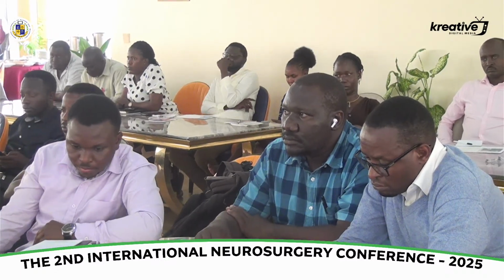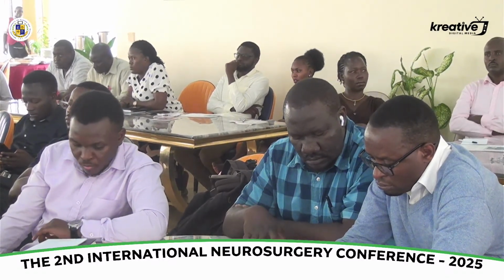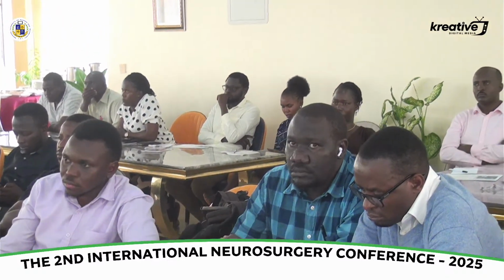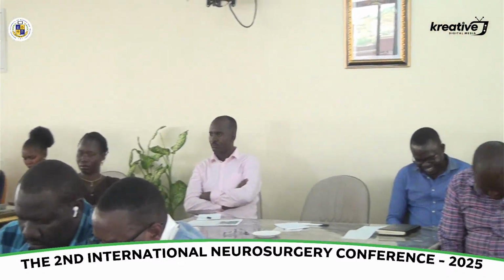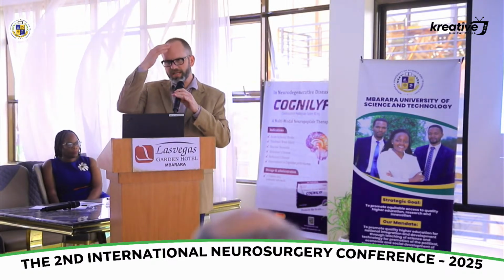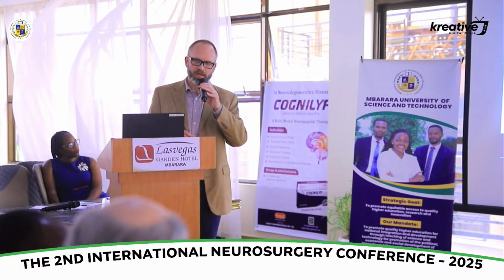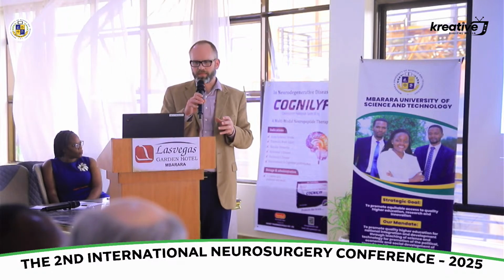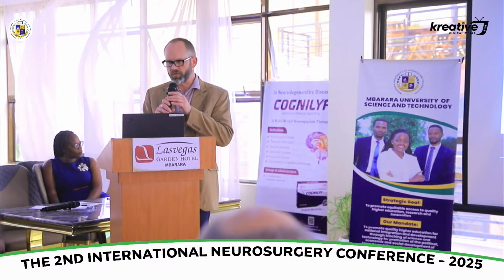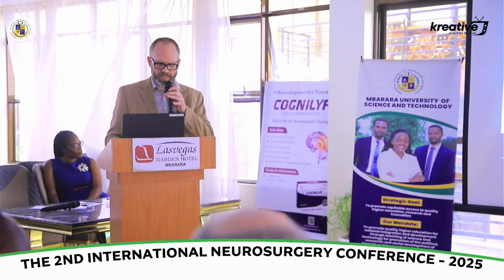So this will be a quick presentation. We'll spend more time on adult ultrasound, but it can be useful to get online images or a textbook of pediatric or neonatal ultrasound of the head, just because radiologists have been doing this longer, because of the fontanelles being open, to get good ultrasound images of the brain for a very long period of time, for decades. So while it's not exactly the same as an adult patient at surgery with pathology, it can be useful to understand what's going on.